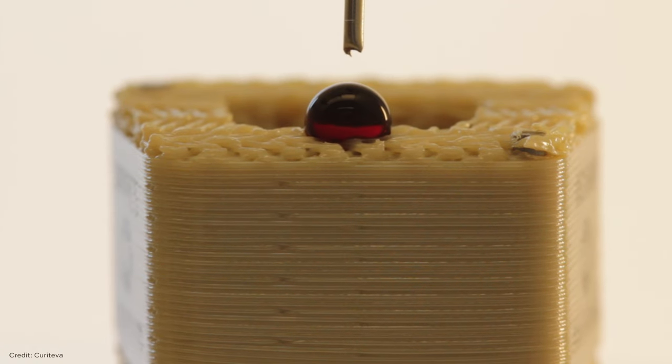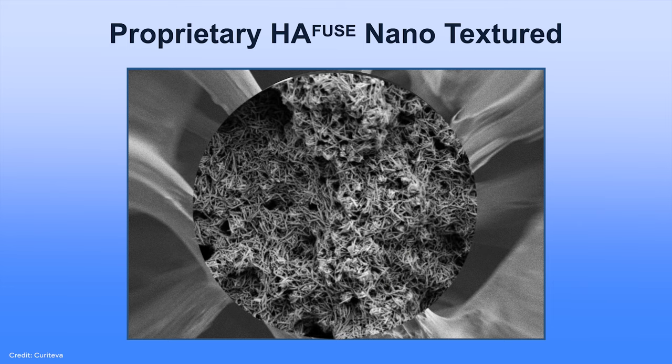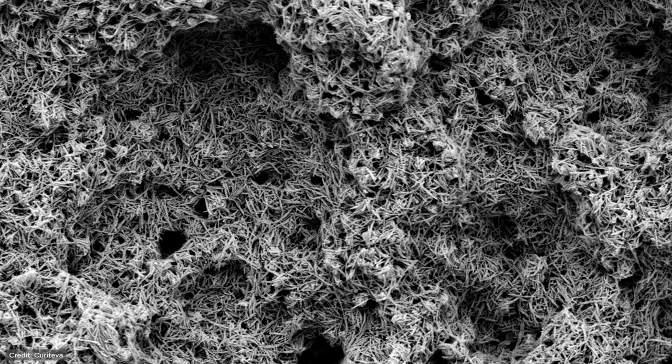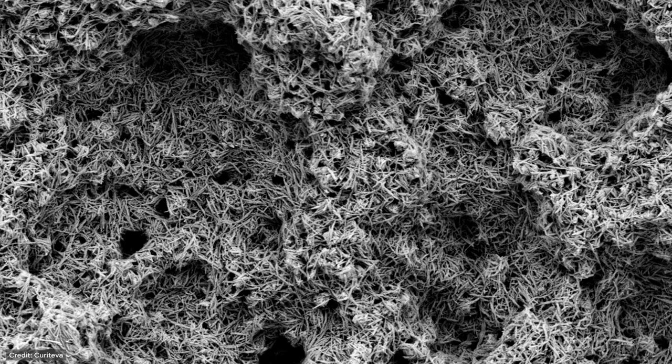The PEEK material is traditionally hydrophobic, meaning it repels, is not loving of water. To make it hydrophilic, one of the things we've done is to apply a nano coating of hydroxyapatite. This becomes important because this is done after we print the part. So it gets on every surface, every interstice, up in every single pore. That liquid is evaporated off, and then nano crystals of hydroxyapatite with the needle-like morphology are adhered very strongly to the surface of the implant, inside and out, all throughout. These nano hydroxyapatite crystals not only makes it hydrophilic, but drives a reaction that forms bone that is known as immunomodulation. So that coating is the way that Curiteva got around PEEK's hydrophobic properties.